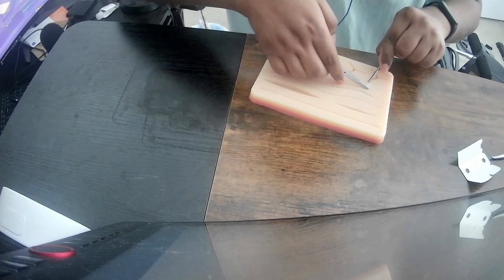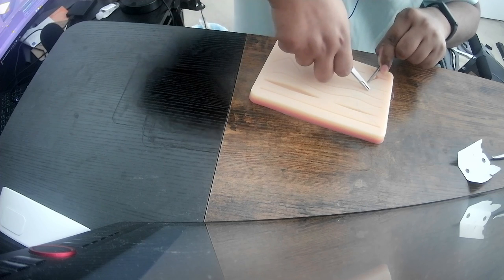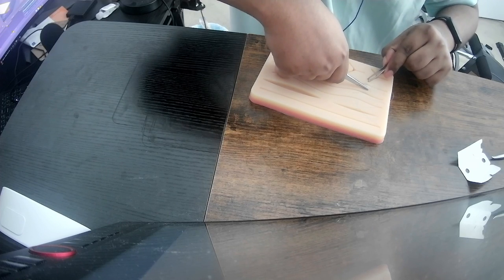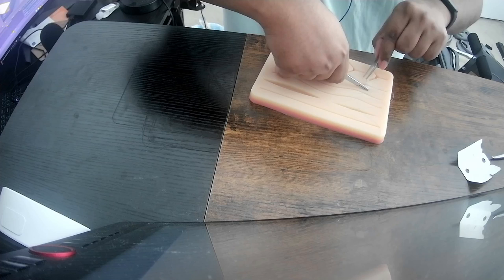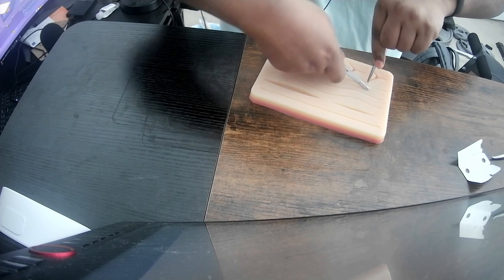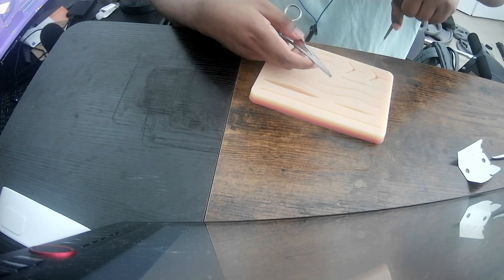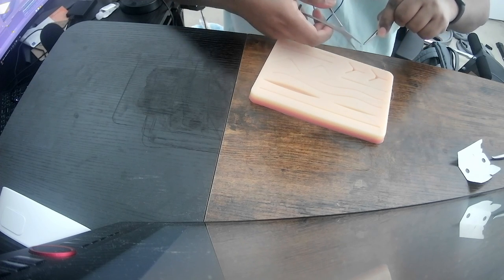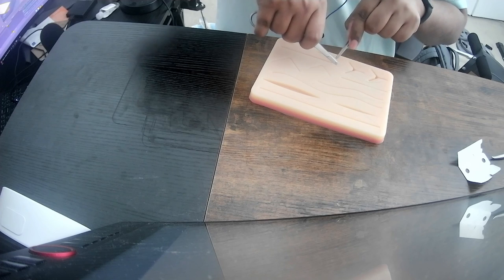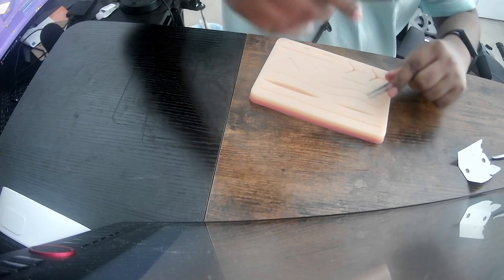Too slow, but it's okay. Oh no! I pinched the skin. Oops! Instead of stabbing the needle with my forceps, I stabbed the skin. Okay, that looks good, I think. Oh shit! I forgot to reload. So much to learn. But it's okay. Again, day one. Hopefully I don't make these mistakes in 4 years, 2 years.